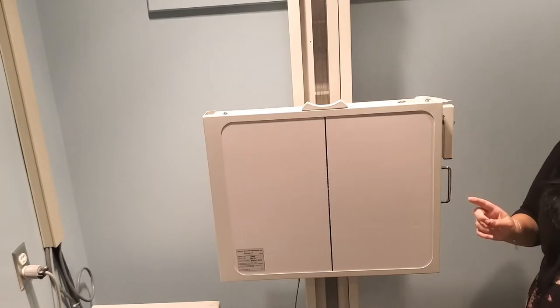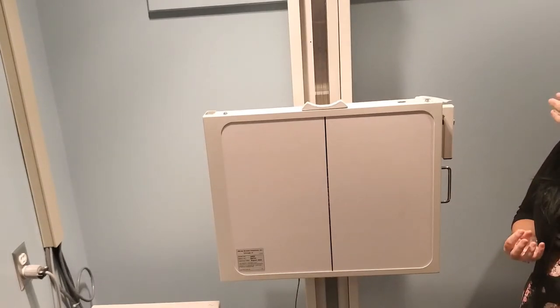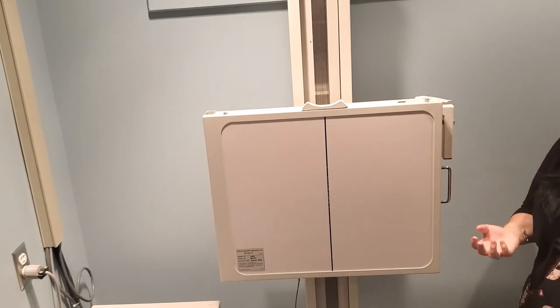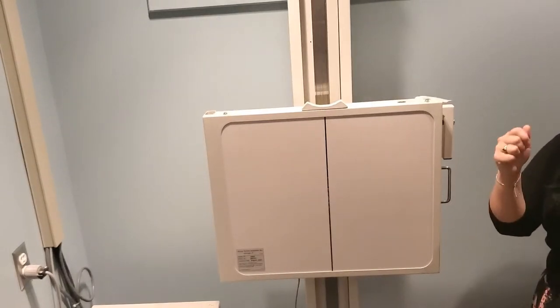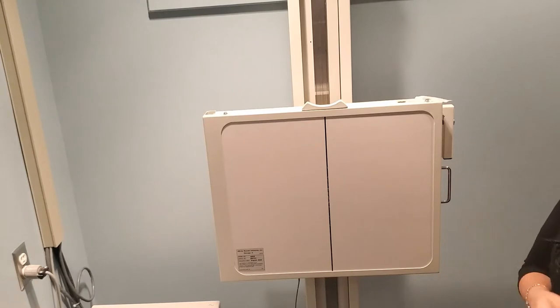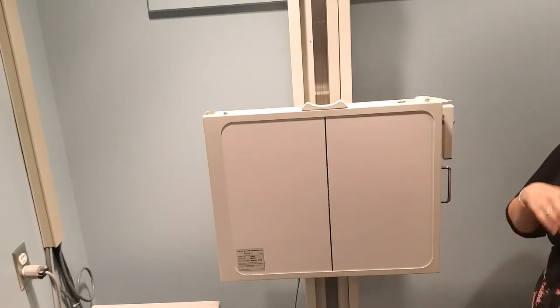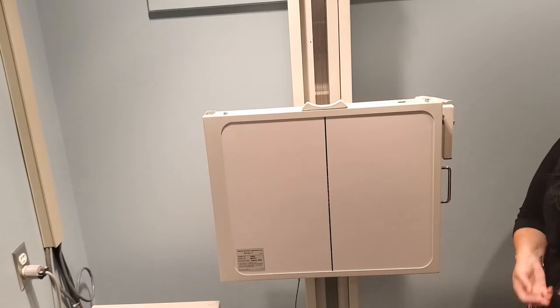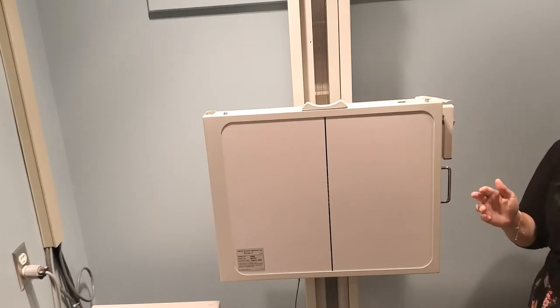A lengthwise cassette is used because that is a longer body part than it is wide. If you're struggling in lab to remember which way to turn your cassette, just think about the body part you're working on. If the body part is longer than it is wide, use a lengthwise cassette. If it's wider than it is long, then it would be crosswise.